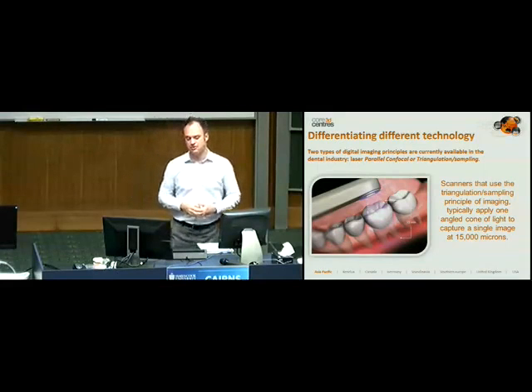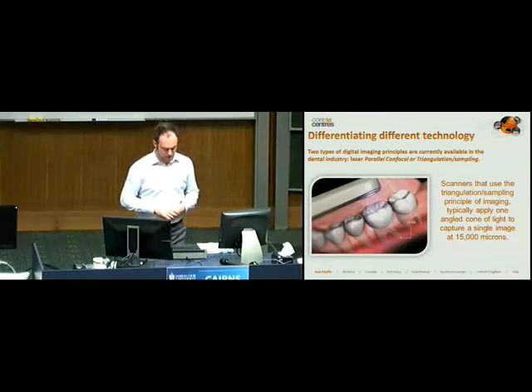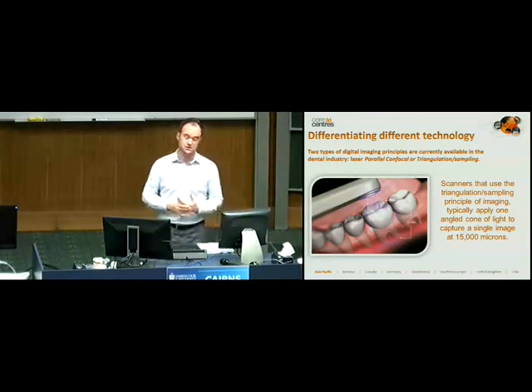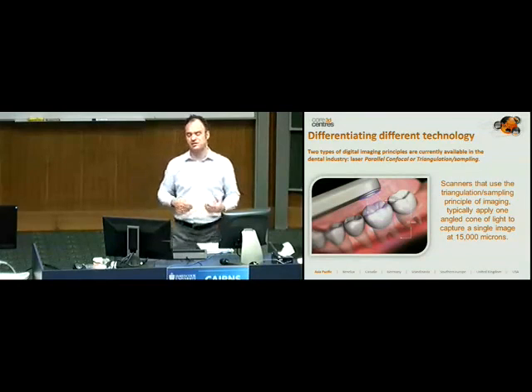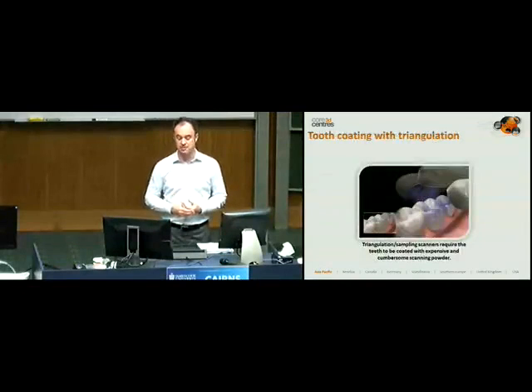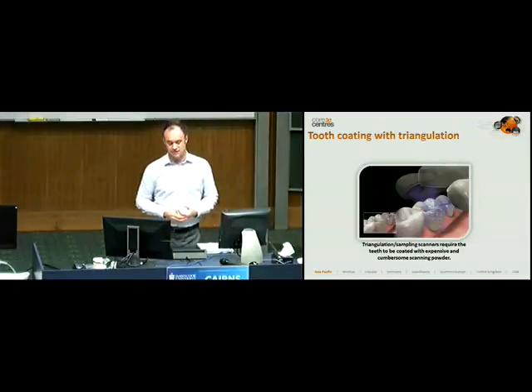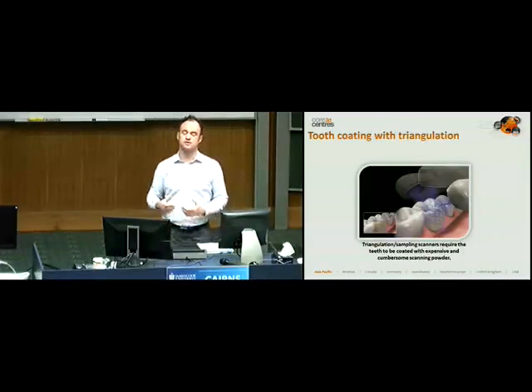These scanners rely quite heavily on the reflective or the bounce of the light back up into the receiver, and because of that, they often don't like very shiny surfaces. And inside the mouth, there's a lot of shiny surfaces. So often you need to apply a thin layer of some kind of powder to enable it to pick up accurately and without any problems. So they're very, very good, but they often rely on having to spend a lot of time in making sure the field is dry. There's powder, and often it needs a lot of retraction, and often there's generally two operators needed, one to retract and one to scan.